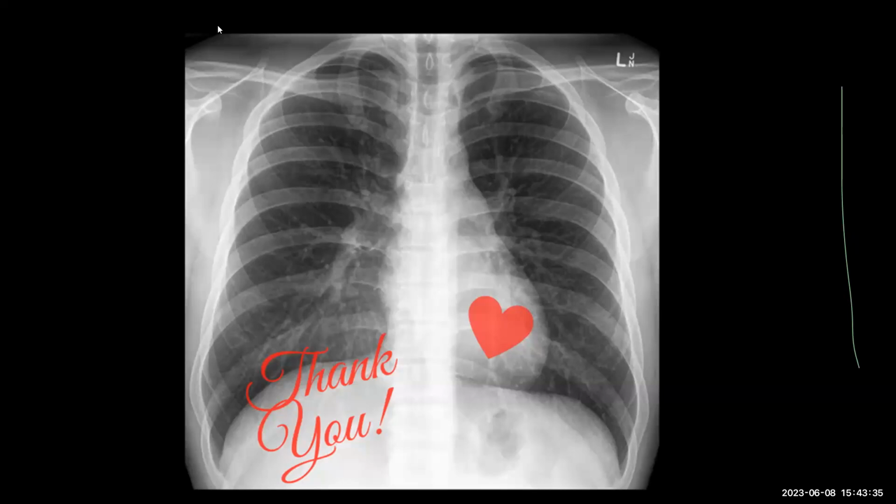that sometimes minor things, like if an annulus fissure comes in contact with the nerve, can cause non-compressive myelopathy. Or if you have facet arthrosis with fluid in it, which makes it slightly unstable, that in a dynamic situation can cause nerve compression. And many of such cases in this part of the world, when you can't find a cause, they actually do a dynamic MR, because sometimes you don't see things on a rest MR which become quite evident on a dynamic MR, which is done with the patient in motion. So that's the last resort. But even then, sometimes you can have cases in which you can't definitely identify something on imaging.